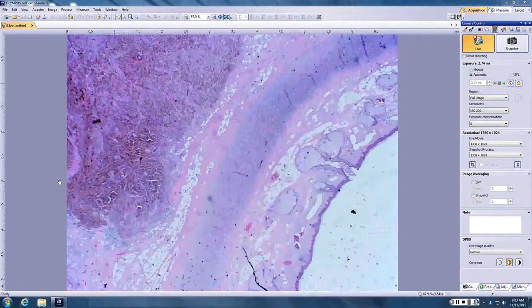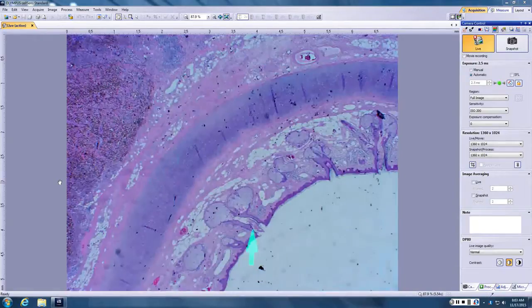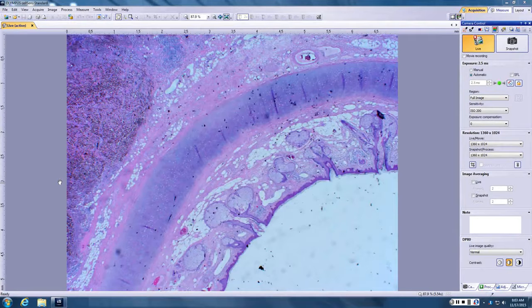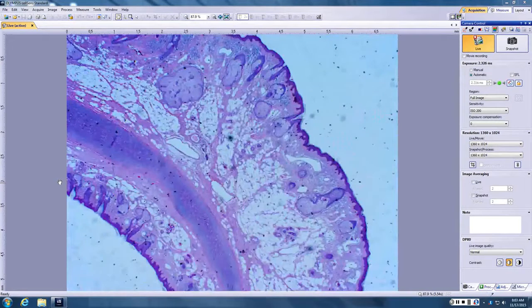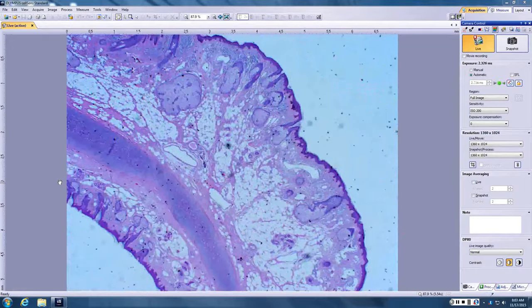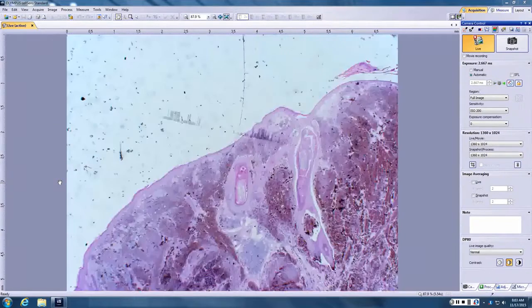Okay, Cheng. First off, where do you think you are? It's cartilage. Cartilage and sebaceous focal. It's maybe an ear. Yeah, it's probably an ear. We're up in the pinna here. Serious. And so what's going on in this ear?